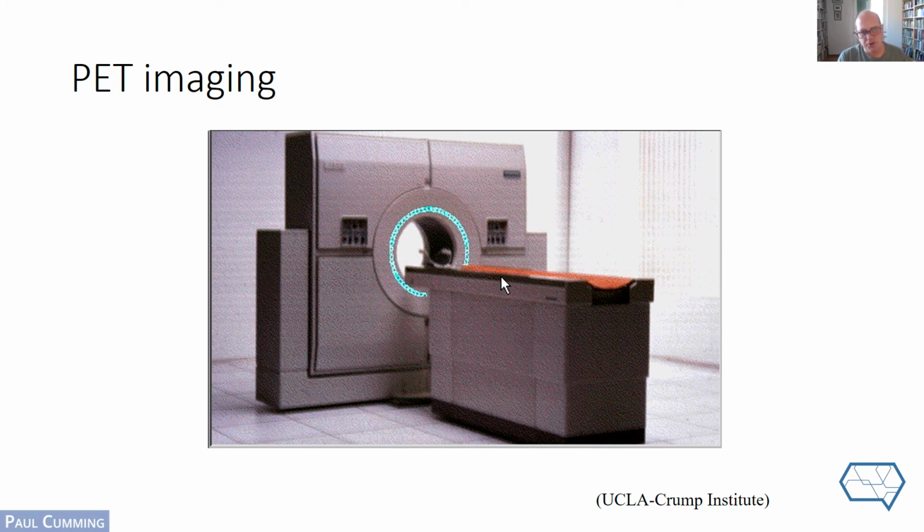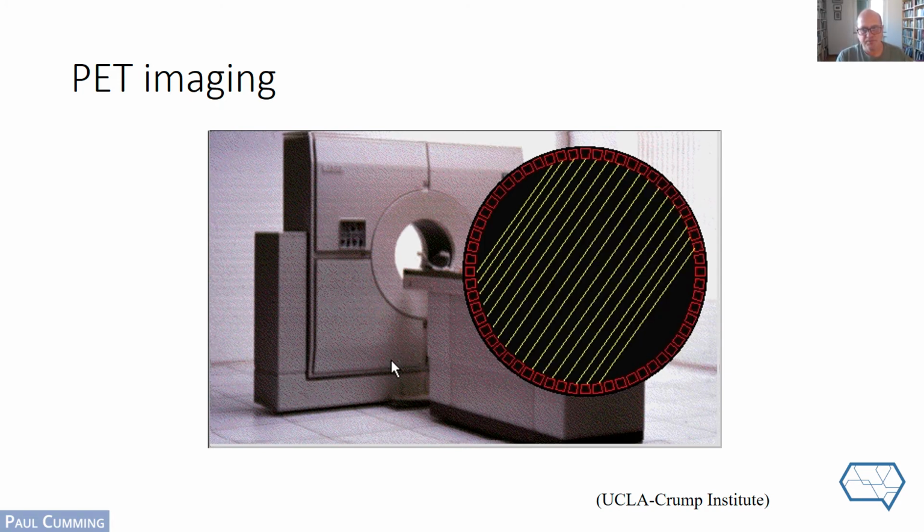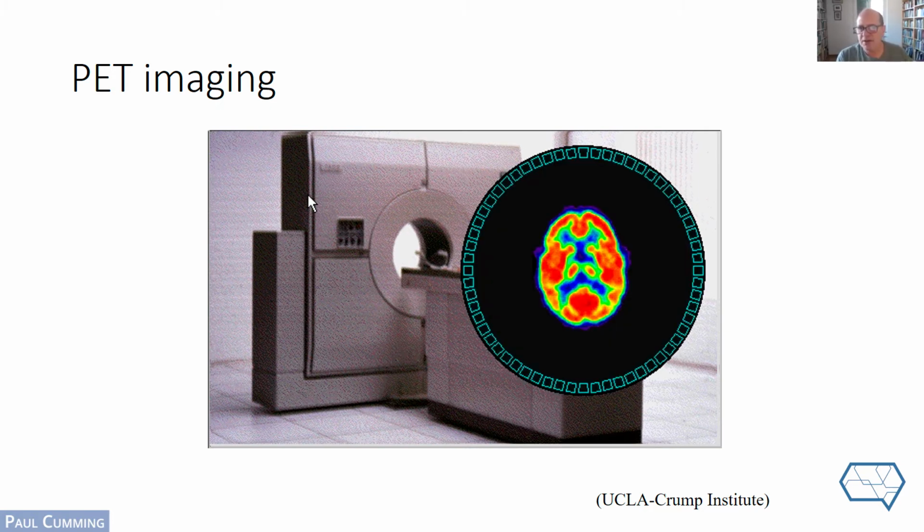And so you see the kinds of rays that are possible for different decay events arising when two detectors, any possible pair of detectors in the ring, are activated in the same moment. And these are parallel rays. And so by counting millions of those events, millions, literally, and applying some algorithms for reconstructing what the source looked like, that's a matter of medical physics, you can produce an image of the source map of the brain showing where the radioactivity came from and how much there was at any time.